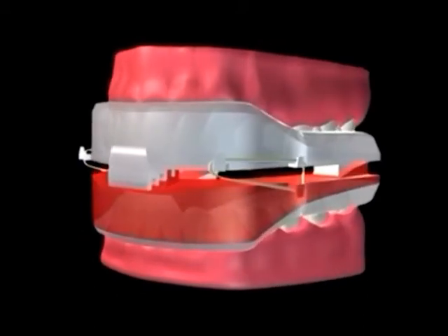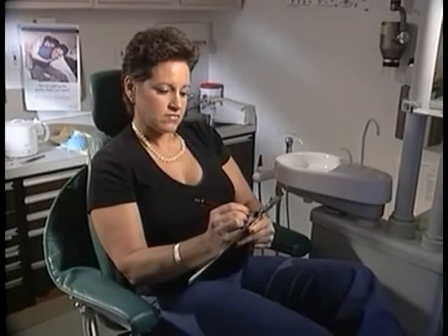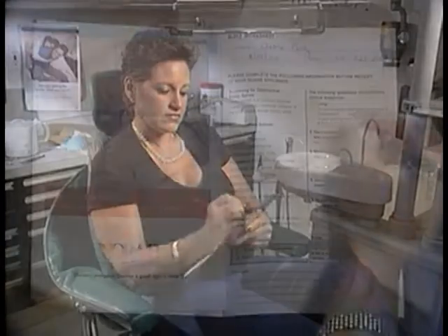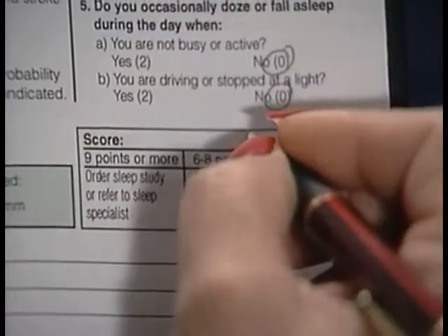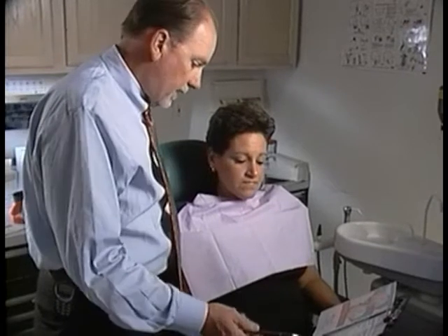To achieve maximum effectiveness and comfort with NORAD, please follow the following instructions carefully. Before proceeding, have the patient fill out the sleep worksheet contained in the NORAD patient care instructions. If their score determines they have a reasonable probability of being at risk for sleep apnea, it is recommended the patient consult with their physician or be referred for an overnight sleep study prior to any further sleep disordered treatment.